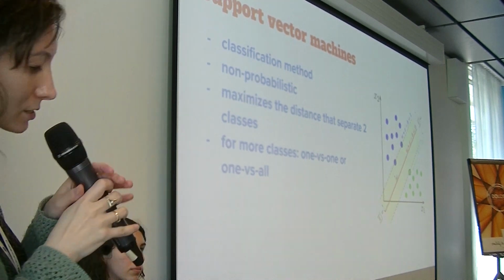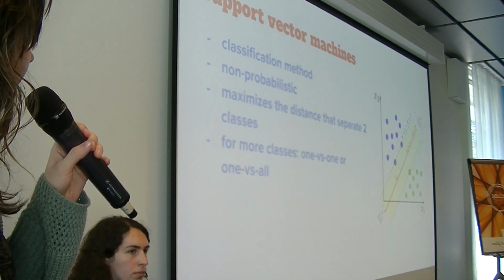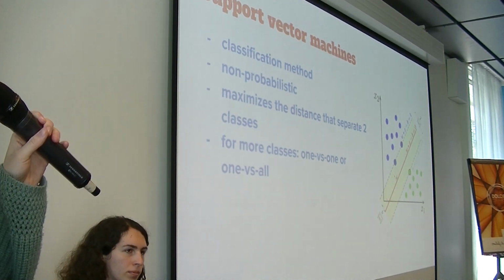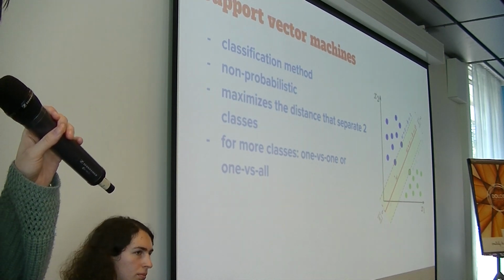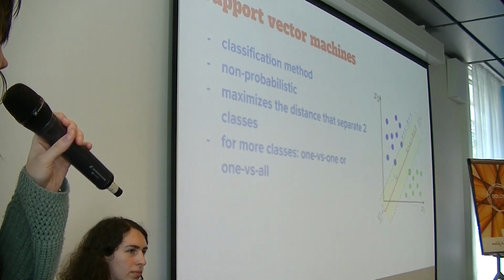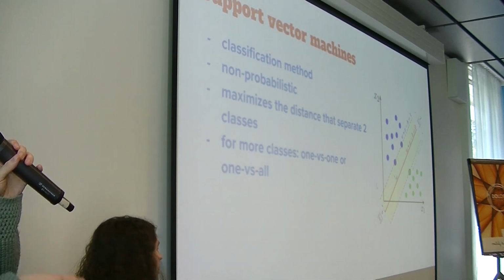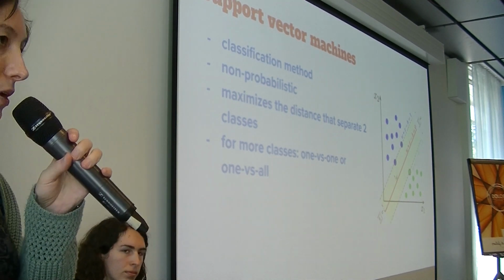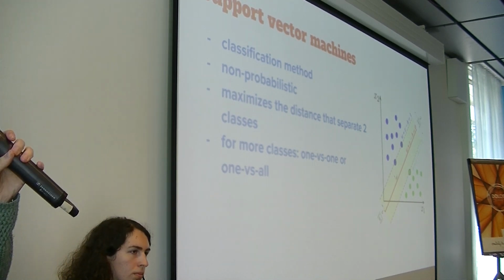The way it works is basically summarized over here. Say, again, in a simple example, you have only two channels or features that the classifier works with. On the axis X would be feature 1, on the axis Y would be feature 2. So it's either channels, or it could be PCA dimensions, or any other output of any other transformation that you perform on your input data, which in our case is brain data.